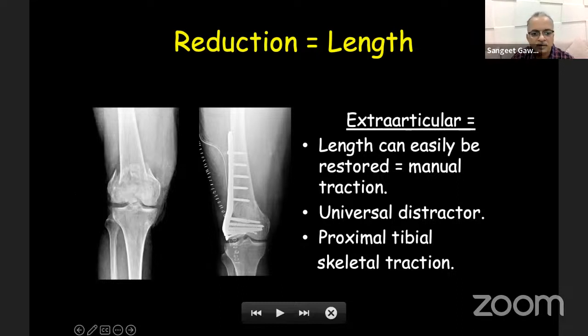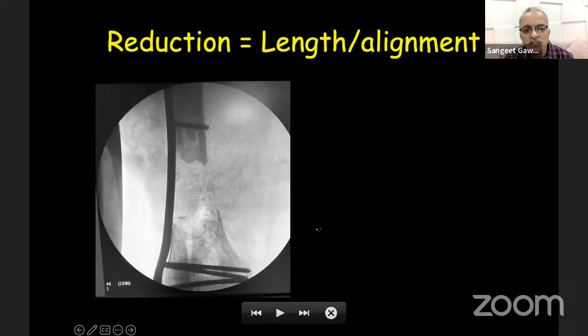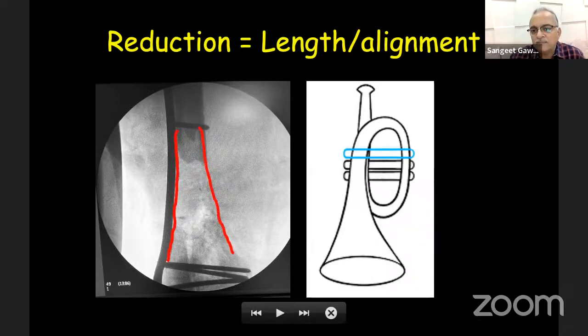However, when you have such a complex fracture, it is very difficult to judge the length. There are two ways by which you can judge the length and the alignment. Here, I don't know whether I have shortened it or it is in distraction when I'm reducing this fracture. So when you are fixing these fractures, just look at the trumpeting effect. The distal femur is exactly like a trumpet, and the proximal and distal walls should be uniformly spreading if you have reduced it well.